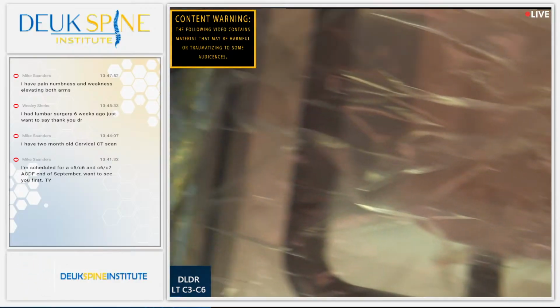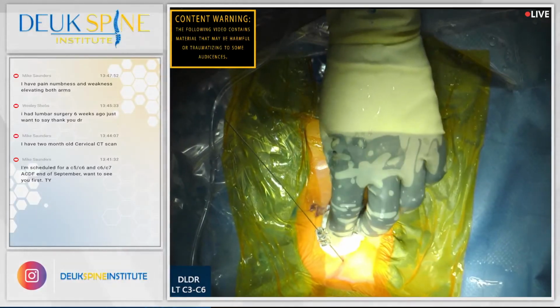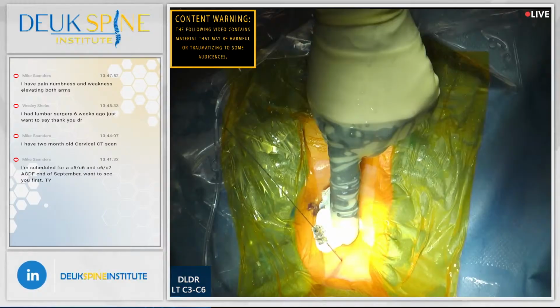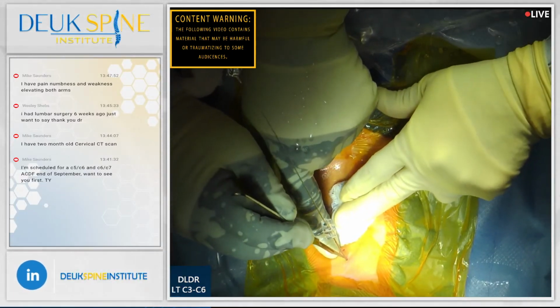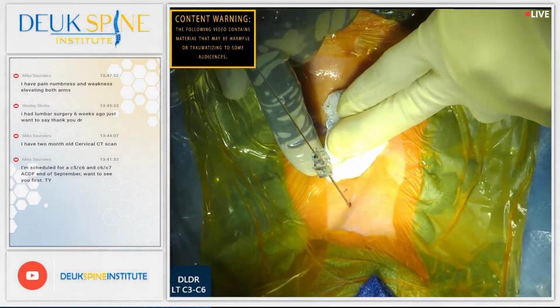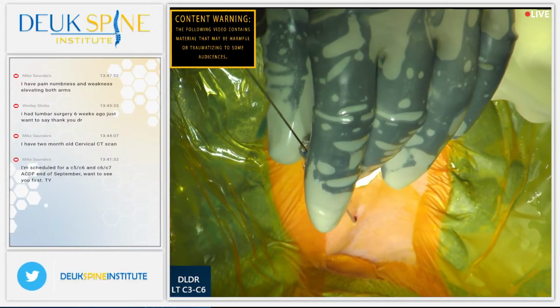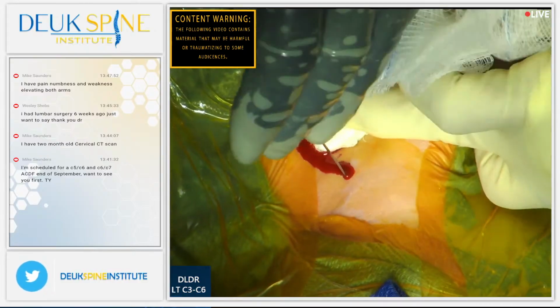We're going to bring the X-ray machine back in. I'm going to make an incision, and we're going to go ahead and get the next 2 discs treated. A little pressure. All right, so again, these are 4 millimeter incisions. 4 millimeters. You guys see that? Tiny. Yes, we did. Shot. All right. You can see the guide wire coming out.